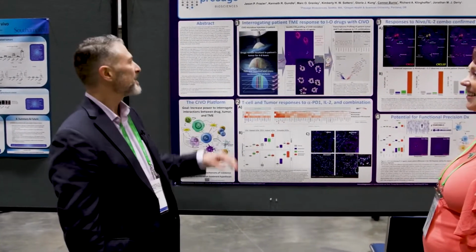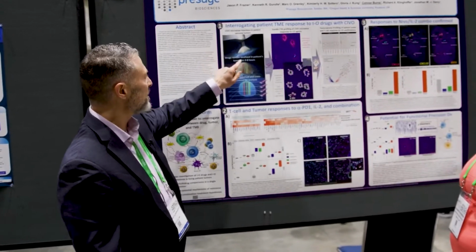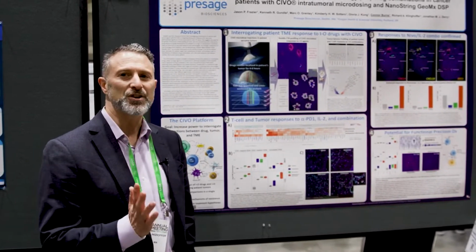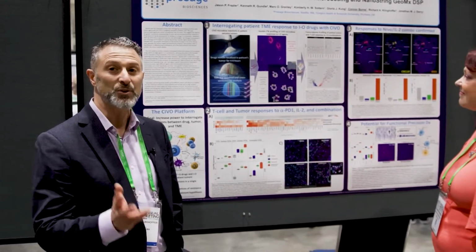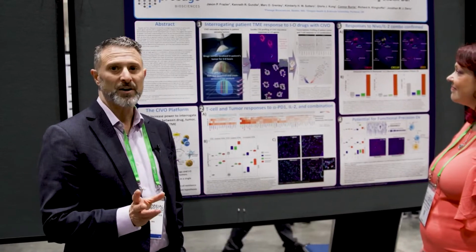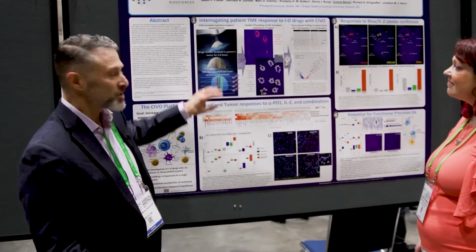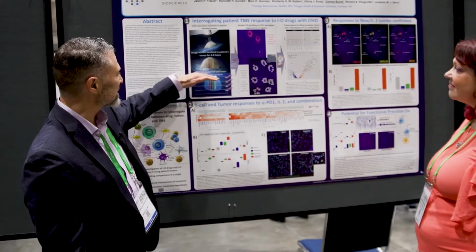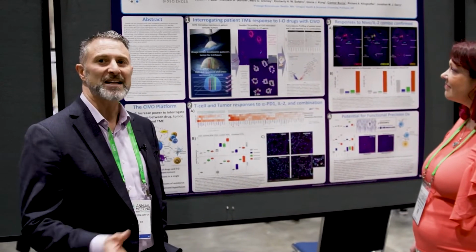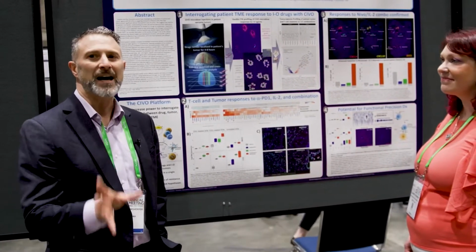The way it works is it starts with a device that gets inserted into the tumor through the skin, and it delivers multiple columns, up to 8 different drugs or drug combinations, directly into the intact tumor. All our patients are scheduled to have surgery as part of their care, so it's therapeutic removal of that tumor. Once that tumor comes out, we take that tumor and section crosswise to these injection columns, and that's where our analysis comes into play, and that's where we're starting to incorporate the Nanostring GeoMx DSP, which is a perfect complement to what we're doing.